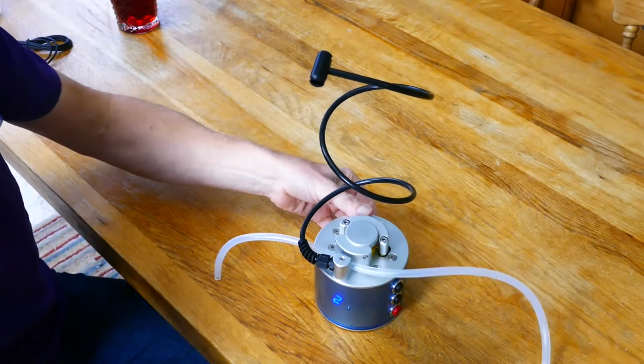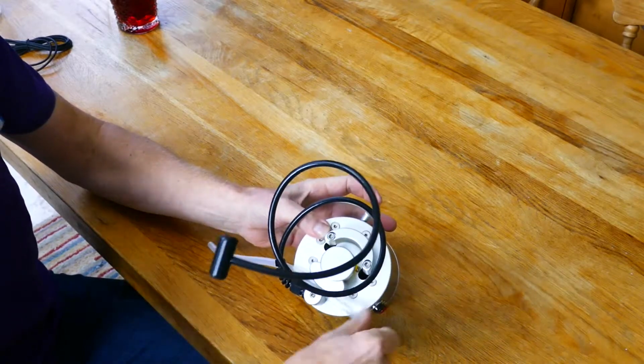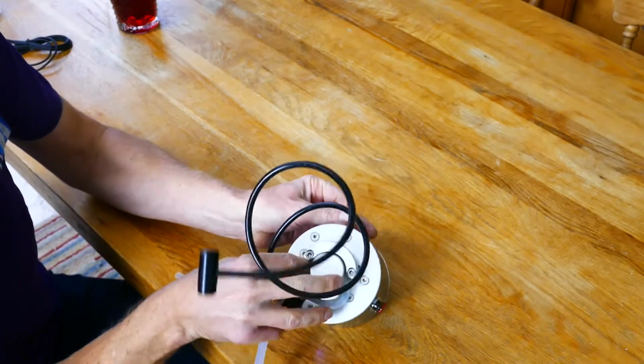Next, I'm going to feed the straw past the pump head. So first of all, I'm going to have to open the pump head. So there's a lever on the back which allows me to open up this gap here. The straw feeds in to the gap. I then push the lever down and it traps the straw.